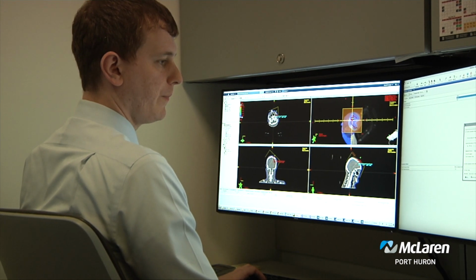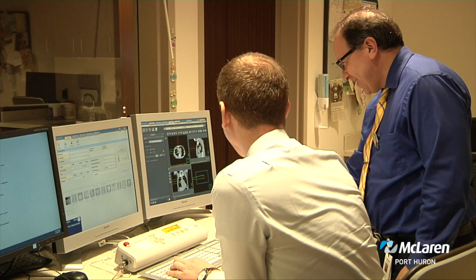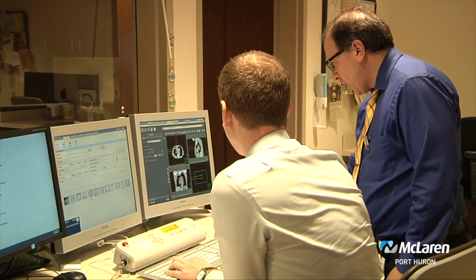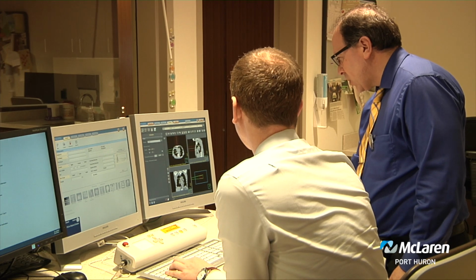Can you give us an example of how the treatment is targeted or individualized? Yeah, if we have a patient come in with a lung tumor, we'll do what we call a 4D CT, which is basically like a normal 3-dimensional CT, but with a 4th dimension of time movement involved as well. It's kind of like a video of the insides of the patient. The tumor in the lung might move different amounts, so we have to analyze it, because if they weren't breathing correctly during the CT simulation, there can be some artifacts. I'm involved in making sure that the 4-dimensional reconstruction is as accurate as it can be, and the area that we are targeting the tumor in looks as good as it can.